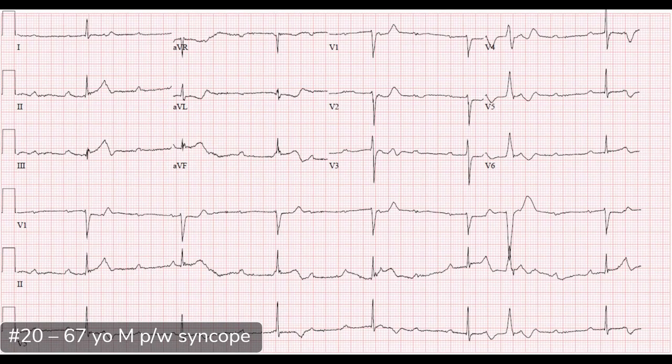So this is our first case for conference number six. Case number 20, a 67-year-old male that presented with syncope. What do you see, John? This looks like a fun one to start off our day with. The ventricular rate looks slow. We count out our QRS complexes and find the rate to be about 40.